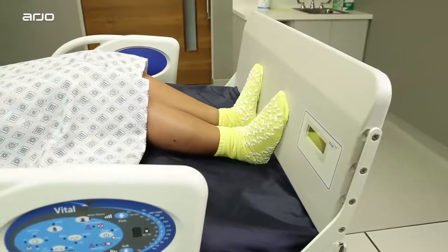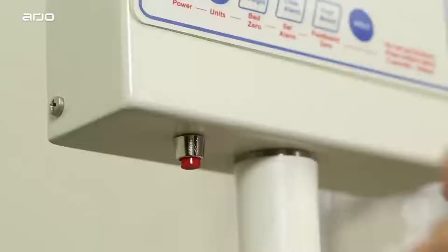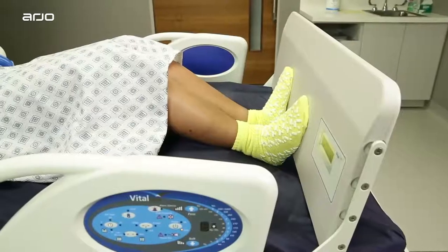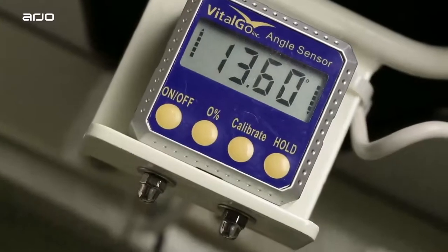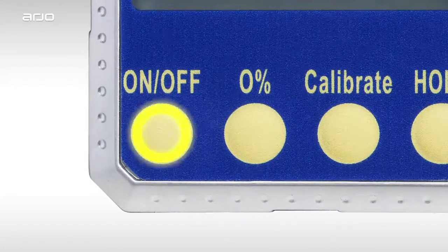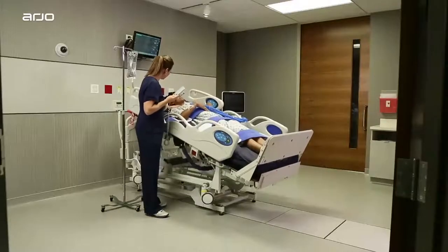It's important to supervise this process. When tilting the patient, you can always manually minimize or eliminate pressure from the foot board. Simply press the red button located on the patient weight scale, which stops the foot lifter from coming in further. The Total Lift Bed comes with an inclinometer on the right side of the bed, which indicates the angle degree of the bed. Ensure the inclinometer is switched on to measure the bed angle. Once the foot lifter stops, the bed will begin to tilt in a smooth and progressive motion.